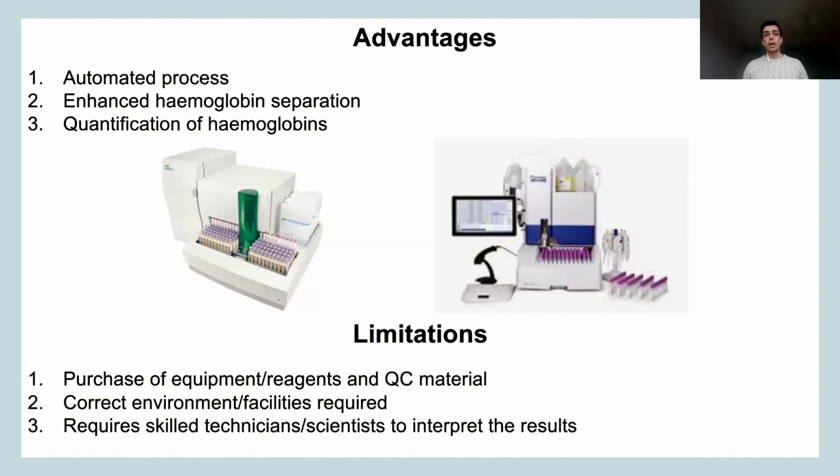Being automated, being commercial, being through all of those bonuses has a price tag. So the equipment itself needs to be purchased or on a reagent rental basis, but you need that. You need to keep it, you need the reagents, and you need the QC material that comes with it, so you have a reliable system and diagnostic service as well.